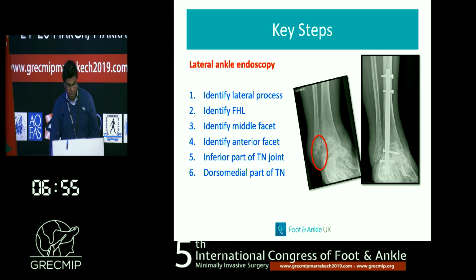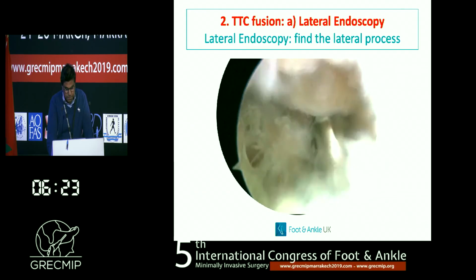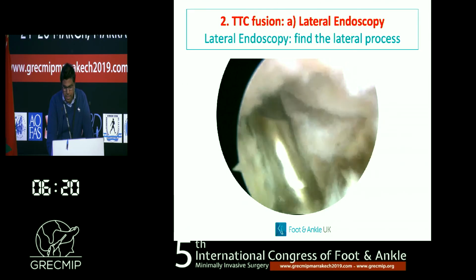This is essential for deformity correction. And from there to move into the anterior facet. This is a small articular facet, but it's important to take this out as well to prevent the talus from dorsiflexing if you do all your work at the back of that space. But the key thing is that this is your access into the talonavicular joint. And from here you can approach the inferior part of the talonavicular joint, and then you can reach into the dorsomedial part of the talonavicular joint. This is the hardest bit to do, but by this stage everything else is mobilised, so you have the freely mobile talonavicular joint.